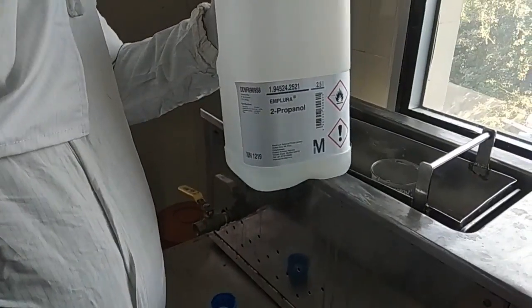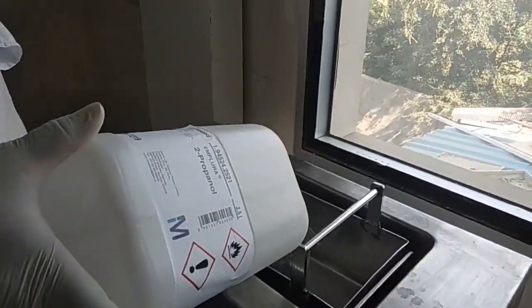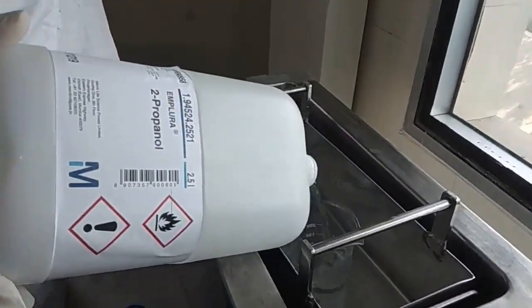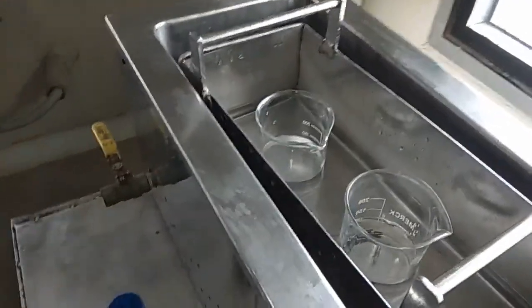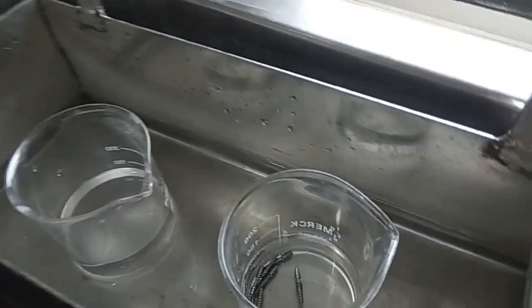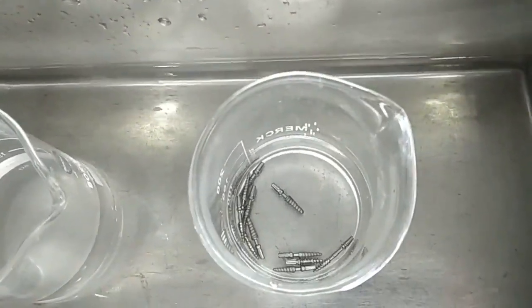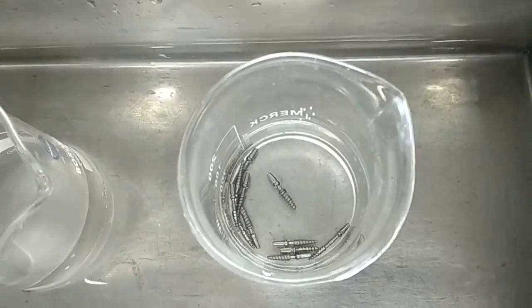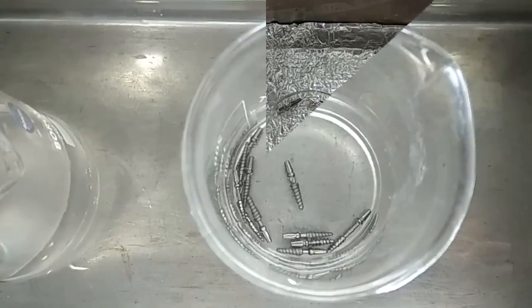Decontamination eliminates many or all pathogenic microorganisms, except bacterial spores. This process is done with 70% isopropyl alcohol in ultrasonic cleaners and in a class 1 lakh clean room environment. Finally, this cleaning process is repeated with pyrogen-free water for injection. Packing material also passes through the decontamination and cleaning process.